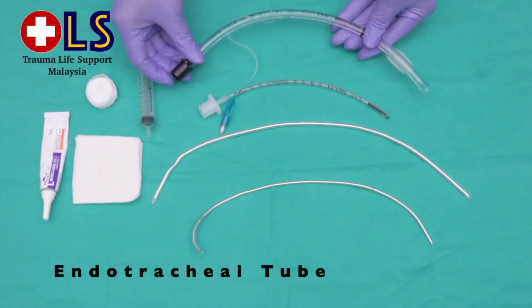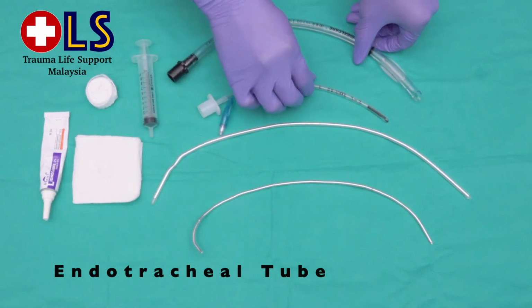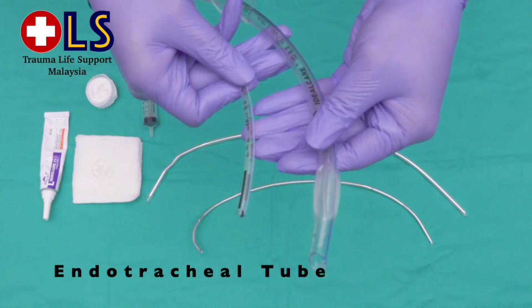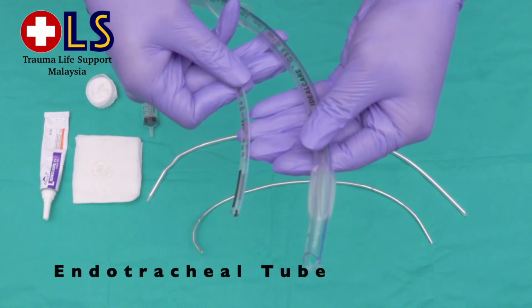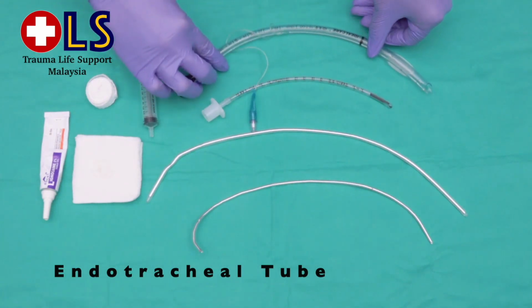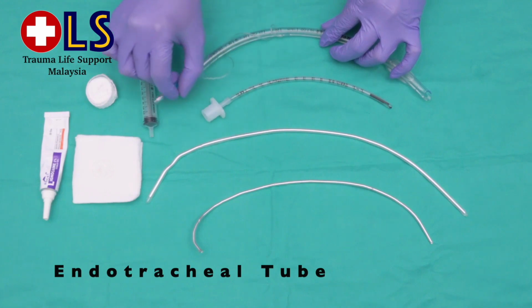This is the cuffed and uncuffed ETT. The usage depends on the clinician's intention of treatment. There are two reasons for an air-filled cuff, which are to seal the trachea from positive pressure leak and from secretion leaking into the pulmonary area.